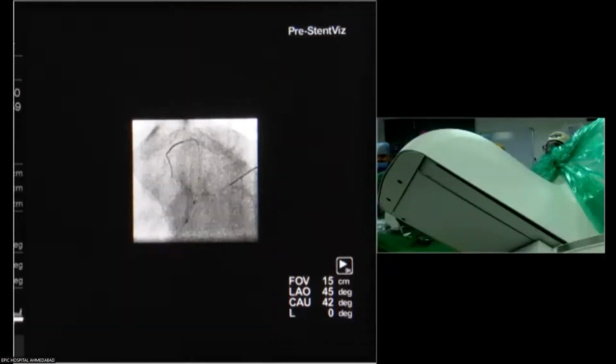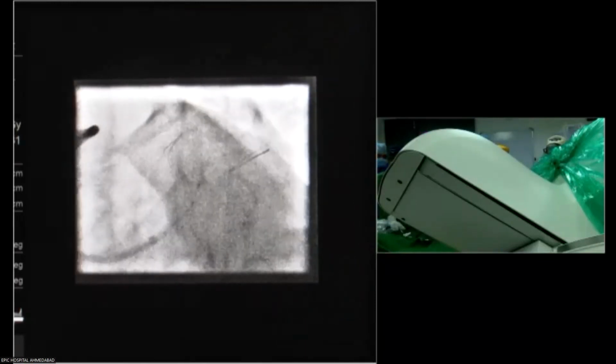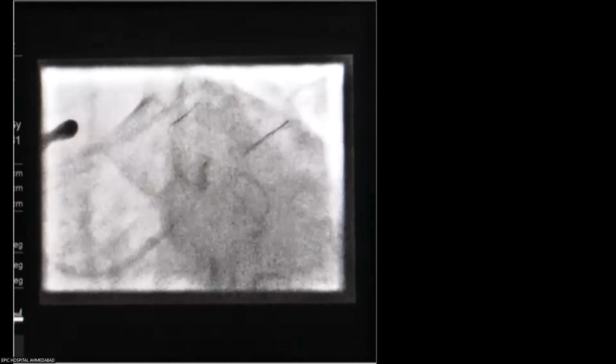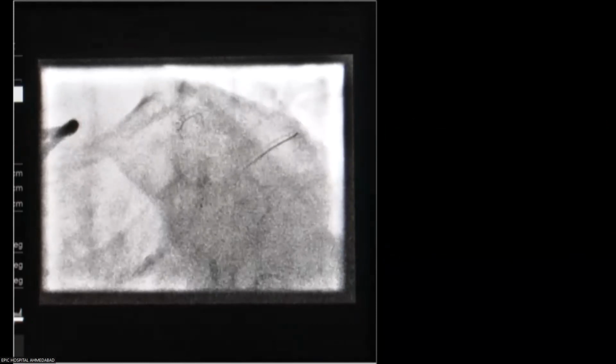Yeah, that's fine. I think that's fine. We still have to go back. Yeah, we'll go ahead. Let's push a little more from inside. Okay. A little more, yes, that's it. Okay. Nominal. You want to show the balloon? You can show the POT balloon, that's not an issue. Okay, store.